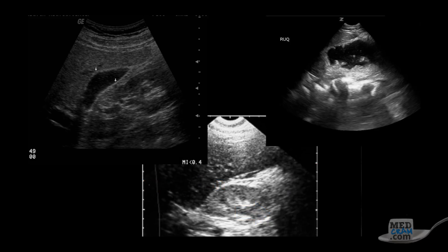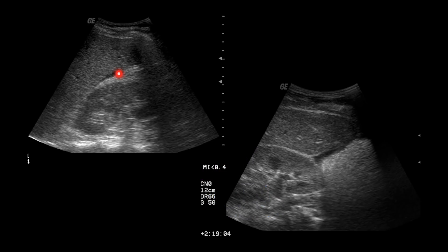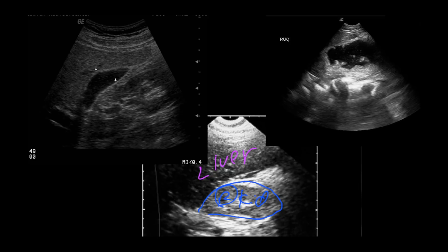The second pitfall is perinephric fat. With the right kidney here and liver here, in between we see a small black strip. This is perinephric fat — usually not completely anechoic, more dark gray — and you'll notice a white line on both sides of it. This differs from free fluid in Morrison's pouch, where you see the kidney lining and free fluid without another hyperechoic lining on the other side. Perinephric fat also tends to be a small strip.